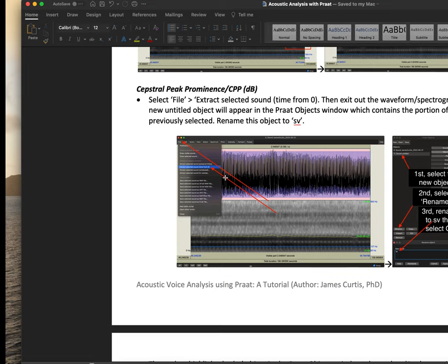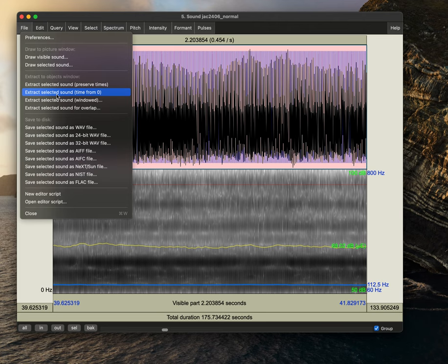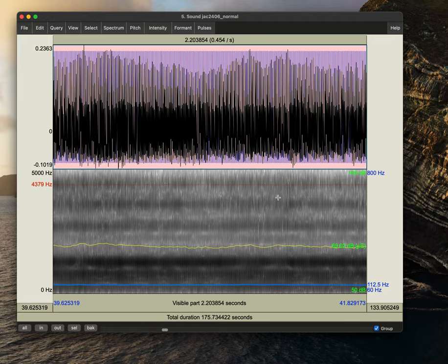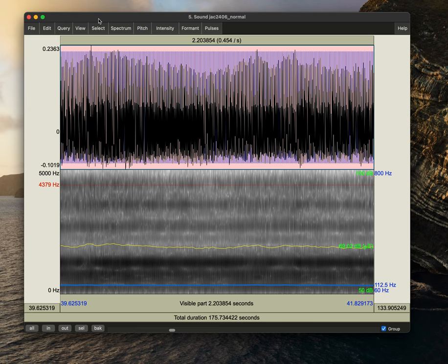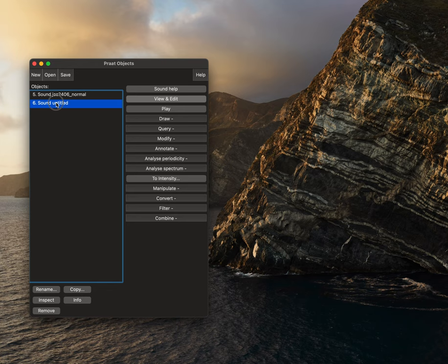The last thing we'll do is obtain our cepstral peak prominence. To do this, we'll select file, extract selected sound, time from zero. And we're going to save this as... what actually already saved. We'll exit out of this.